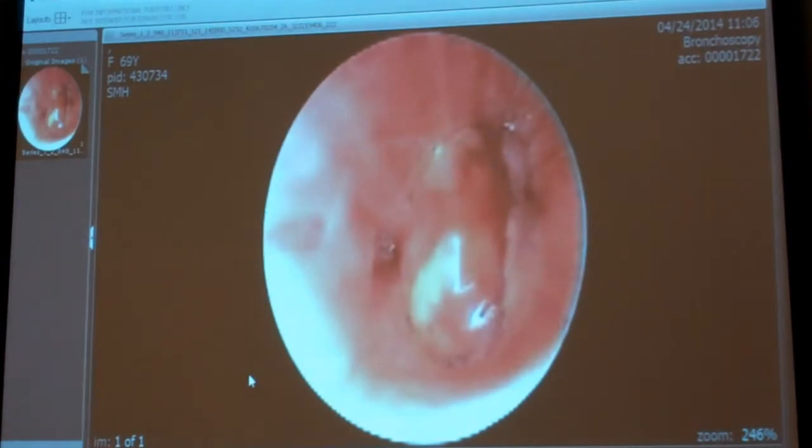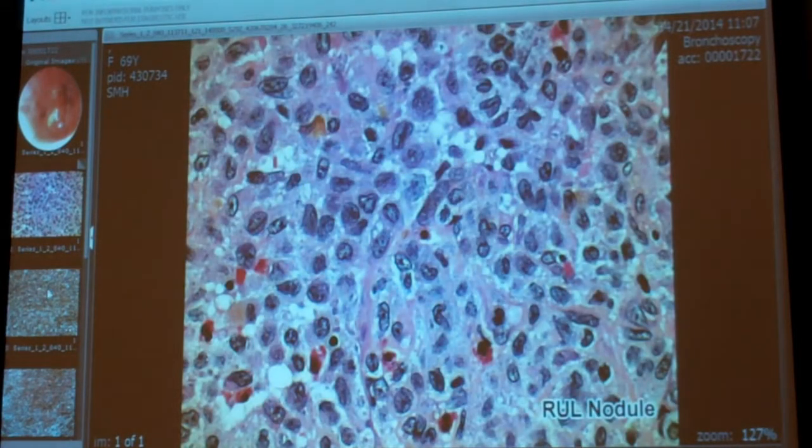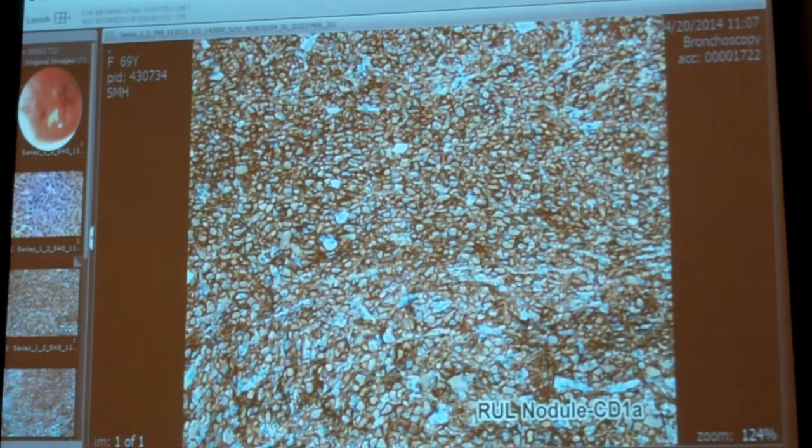And this is 99% of our existing viewer code. The only difference is that we connected the WADO-RS web standards instead of using another web standard that we developed against. And so as you can see, we're pulling in images that are real, and this one happens to be on the McKesson.